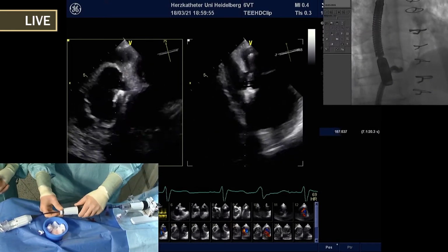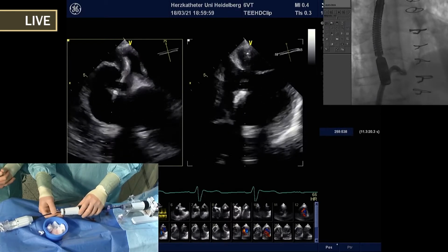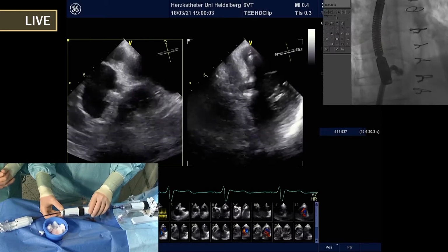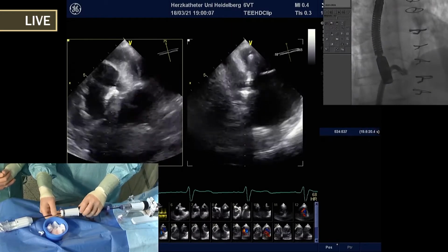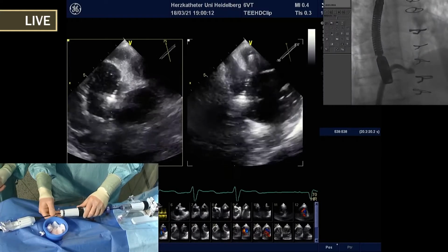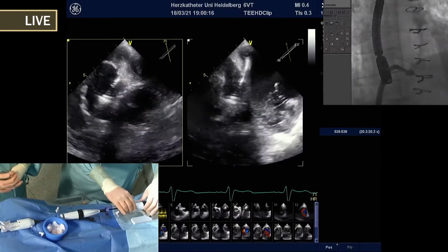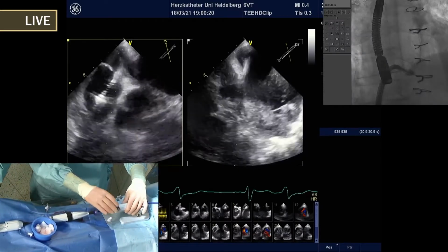So this is the inflow chamber. Actually, that's the best to steer. You see the aorta on the right-hand side. So this is anterior, and the flex goes posterior to the 5 centimeter sign at about 9:30. Now you're perfectly aligned to the commissure already, and with this prominent Eustachian valve, treatments in the anterior to septal leaflet are typically easier than going very posterior.